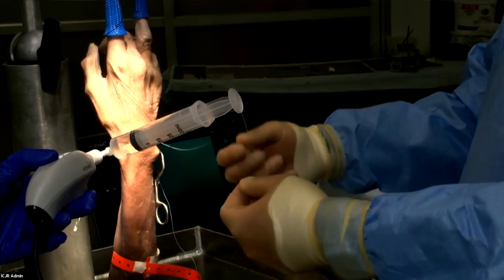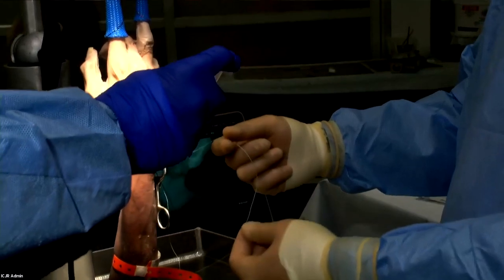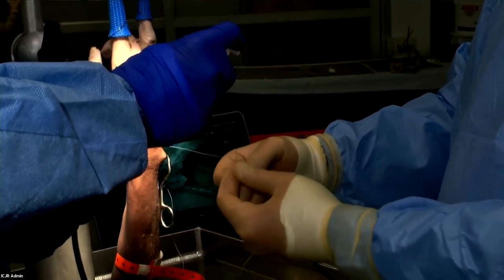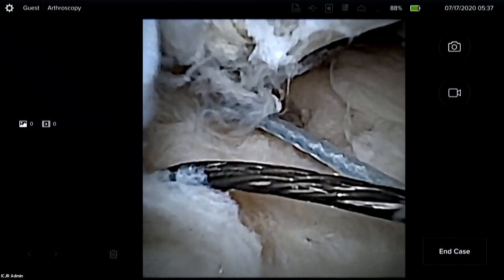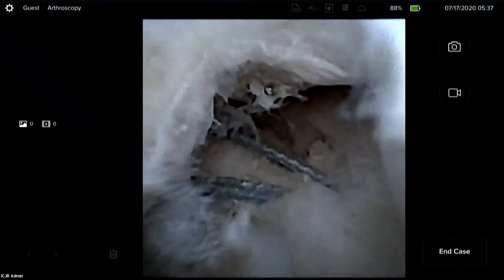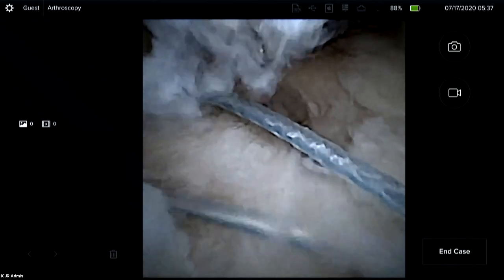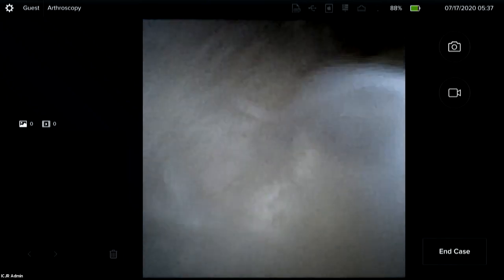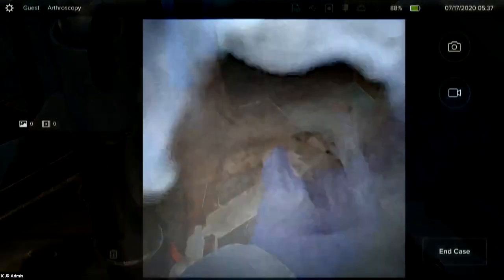I've already passed the FiberStick and the nitinol loop wire. Now I'm going to pass the FiberStick back through the suture lasso loop and pull that out through the ulnar tunnel. Now I've got both limbs of my FiberStick going out the ulnar side. When I pull on them, you can see how the TFC tensions back down to the ulnar fovea — that's the look we're going for.